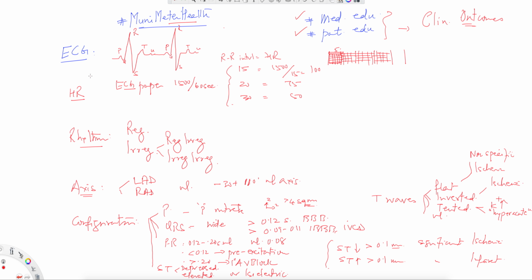In fact, this was suggested by some of my very close medical students who are watching on MuniMeterHealth. Somebody asked me, why don't you do a video, Dr. Jaitly, on a simple ECG where you define how to measure the heart rate, and what are the things to look for in a small strip. So we'll try to cover that in a very short manner here. But again, it's not an exhaustive ECG review, just a supplement to the review that you normally are required to do as part of your curriculum.